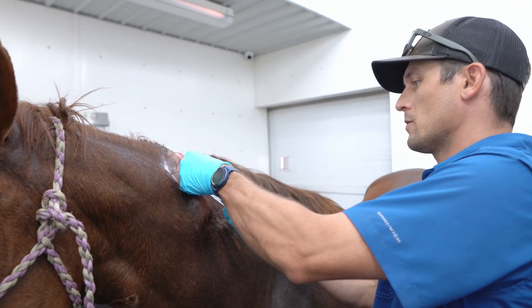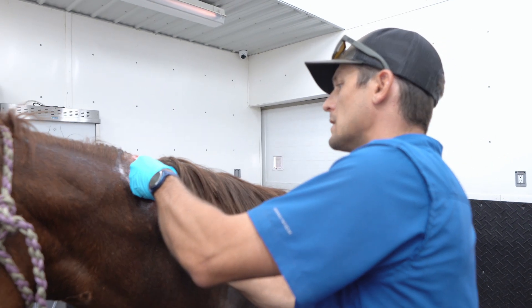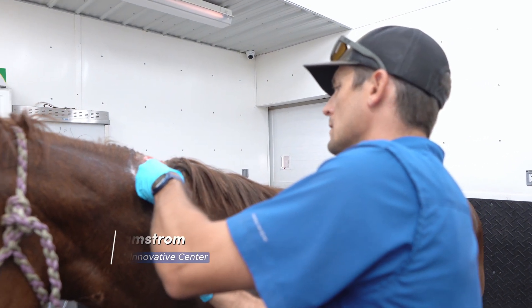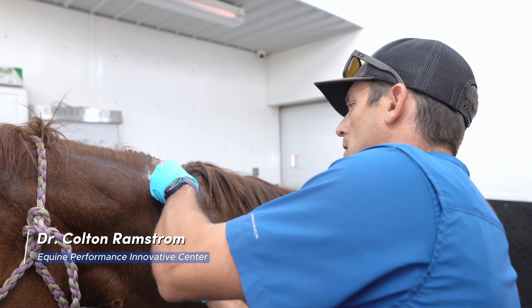We're putting a little local anesthetic along with some steroid in here to block and decrease inflammation before we get to scraping on this thing.